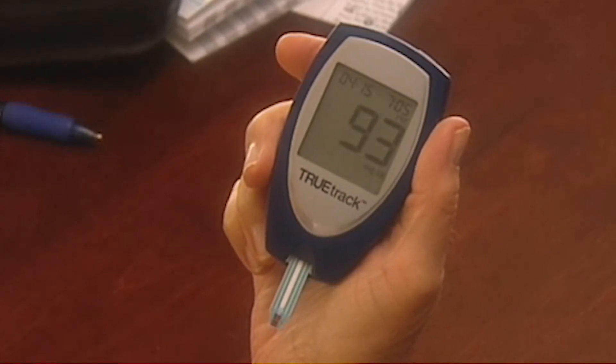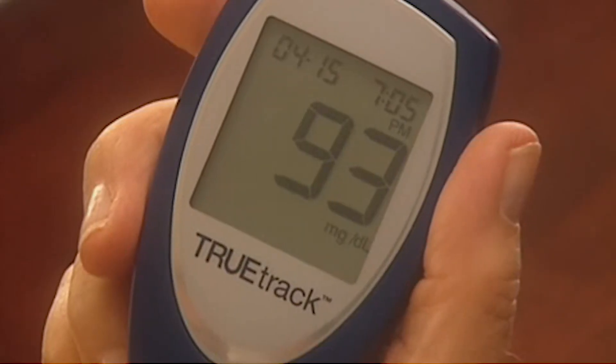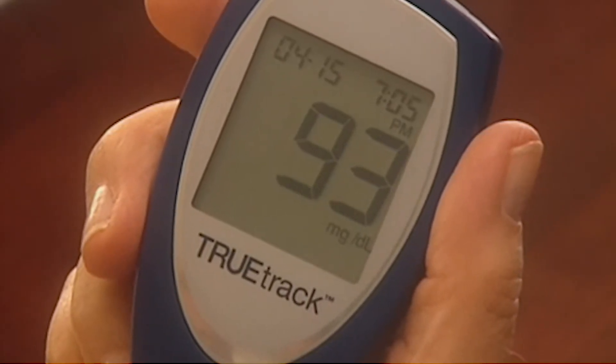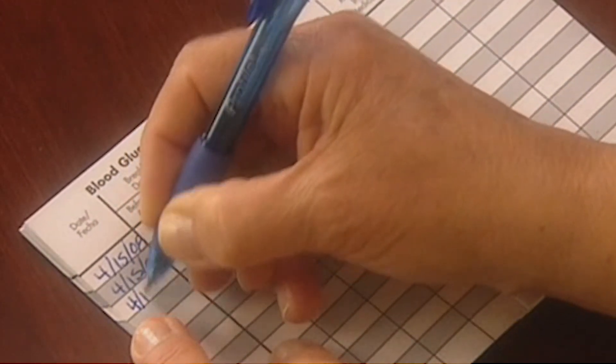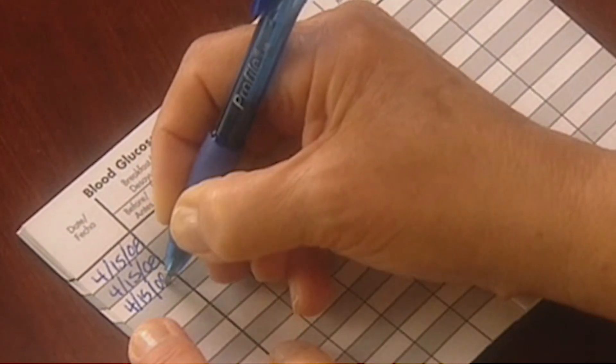Within just a few seconds, the glucose result is displayed along with the date and time. Make sure to record this test result, date and time, in the logbook included with your TrueTrack meter.